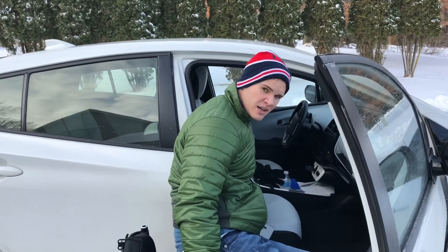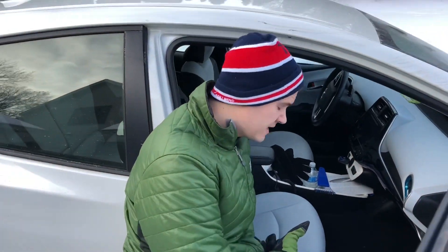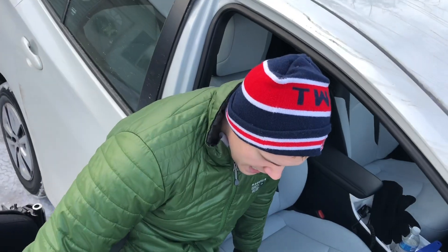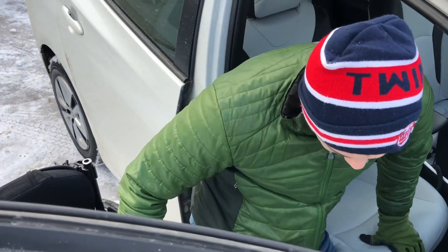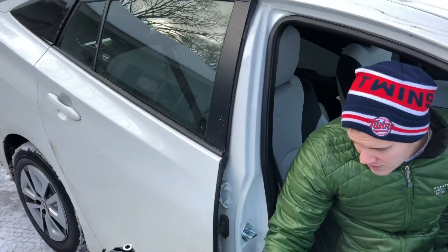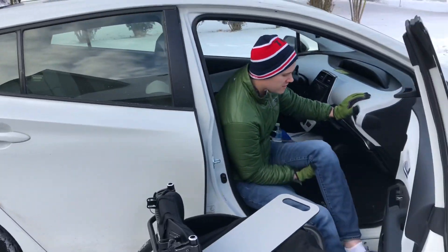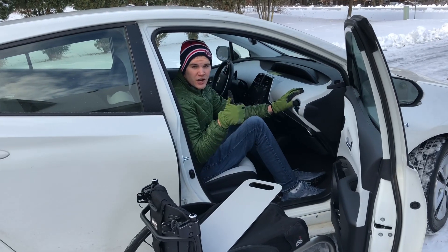You can see that the board is on my chair and it's on this seat. So now I'm going to slide myself in — and now I'm in. I'll get my legs in also, lift them up. Good to go.